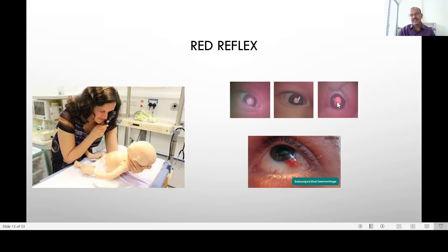Sometimes it's difficult to assess whether it is a pale fundus or whether it's a failed reflex. You can wait for the baby to move or turn the baby to the side — if you see the blood vessels streaking past, then it's just a pale fundus.